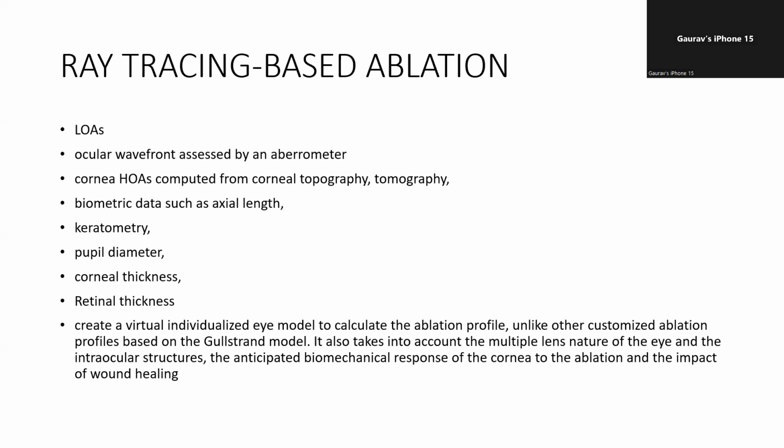Another platform that we have is ray tracing based ablation, which is not in common use. It considers a wide variety of parameters, including the lower order aberrations, ocular wavefront as assessed by an aberrometer, corneal higher order aberrations generated from topo and tomo maps, biometric data such as the axial length, keratometry, pupil diameter, corneal thickness, and retinal thickness. What is unique in ray tracing is that an individualized eye model is created on the basis of all this data.